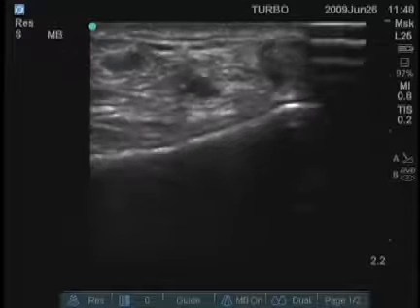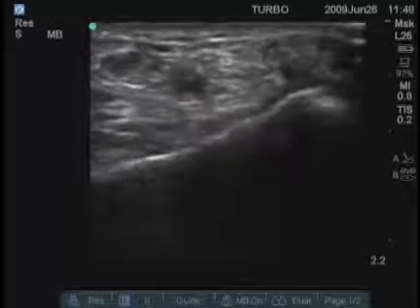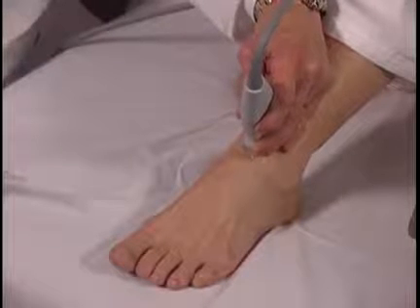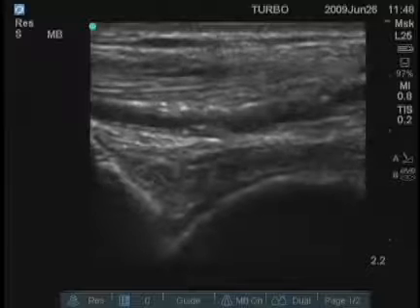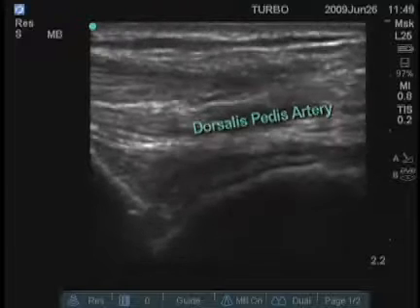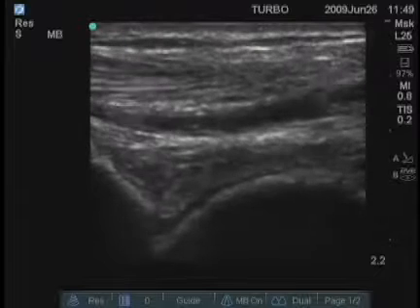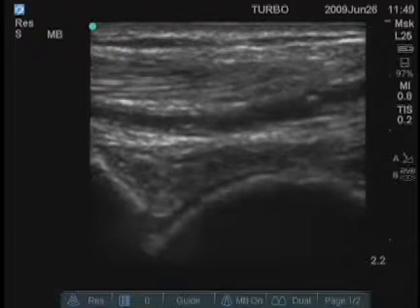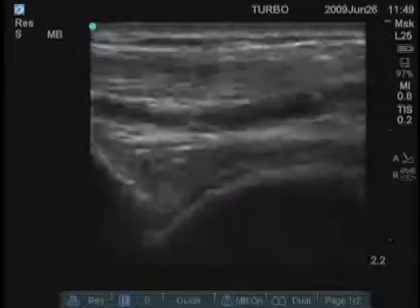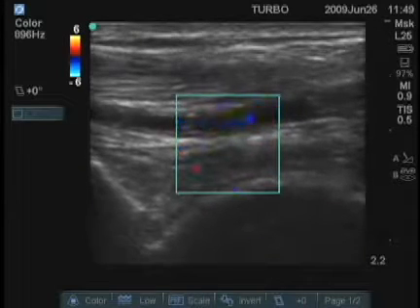It's very important to watch for arteries — you can see the artery pulsating in the center of the field. When the transducer is in the longitudinal plane, it's important to look for blood vessels. This large vessel, most likely the dorsalis pedis artery, is right superficial to that structure. This can also be checked by switching on the color and seeing the artery pulsating right there.